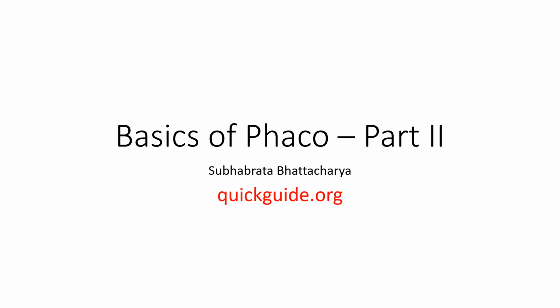Friends, in part 1, we talked about the fluidics and we discussed the different pump systems that drive Phaco machines. We also took special note of the peristaltic pumps. In that section, we talked about how flow is a function of the pump rotation and how vacuum rises in a peristaltic pump after the occlusion of the Phaco tip.